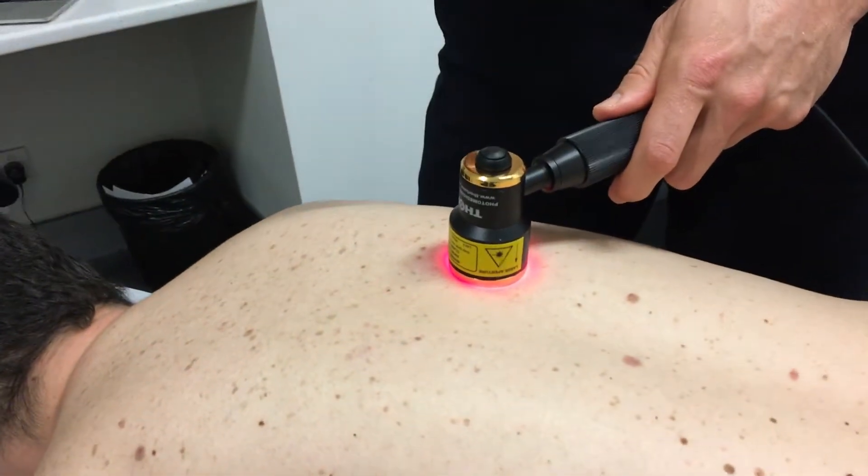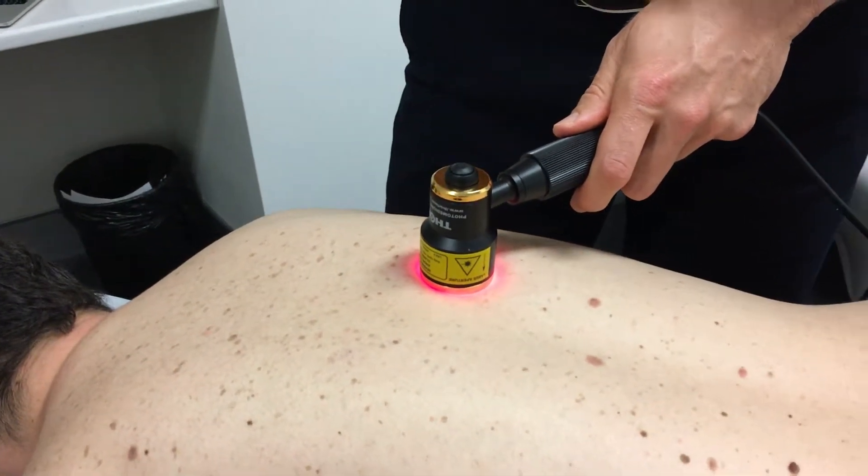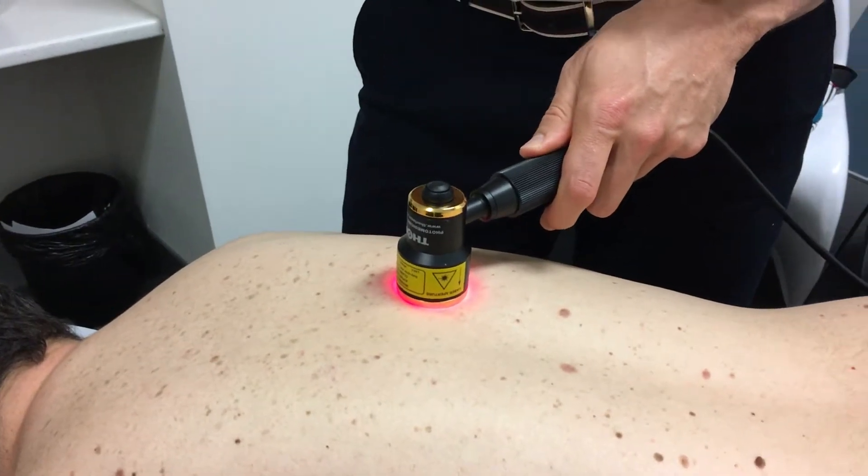Usually patients like to feel something going on, and with cold laser therapy it's a bit of an anticlimax in that respect. But the research is overwhelming — it's shown that we are achieving a lot of tissue repair and reduced inflammation with the use of this. The way it works is it has its effect on a protein in mitochondria called cytochrome C oxidase.